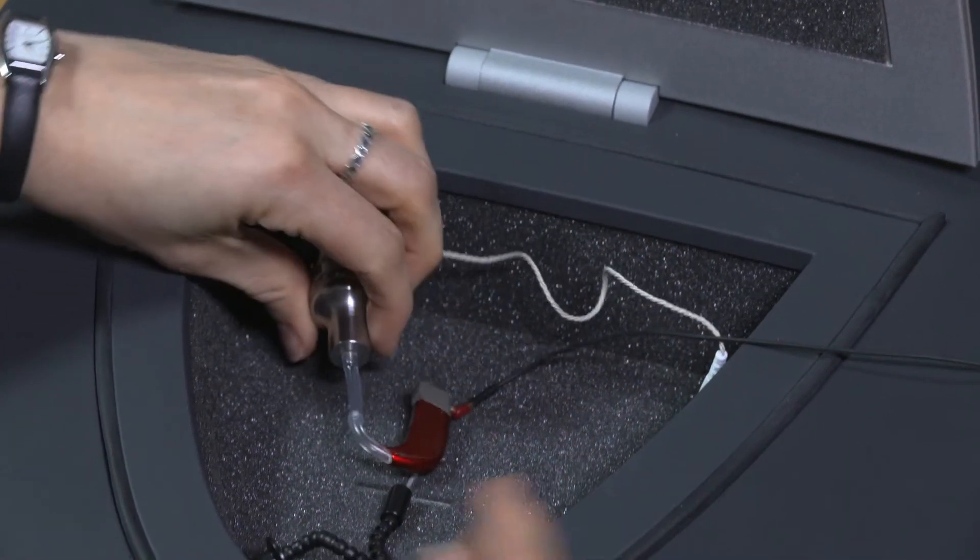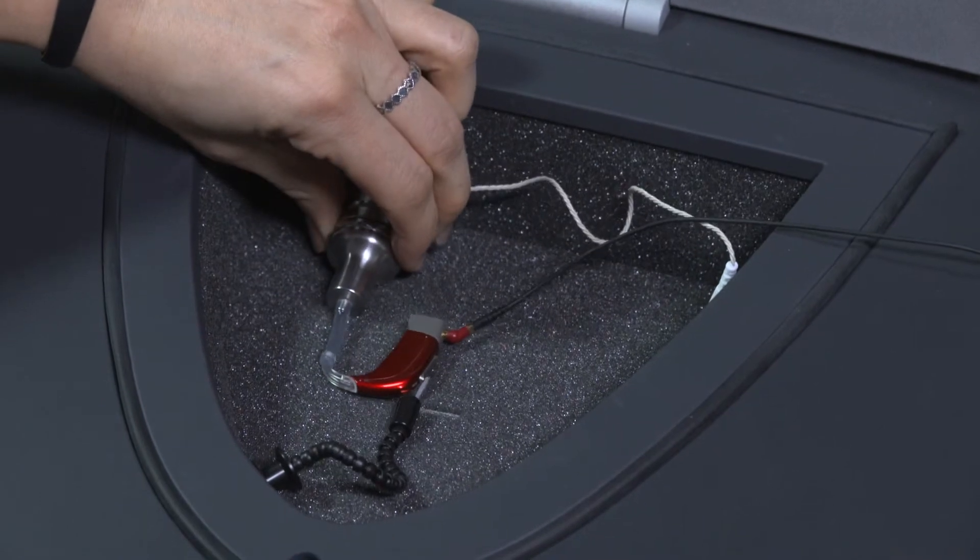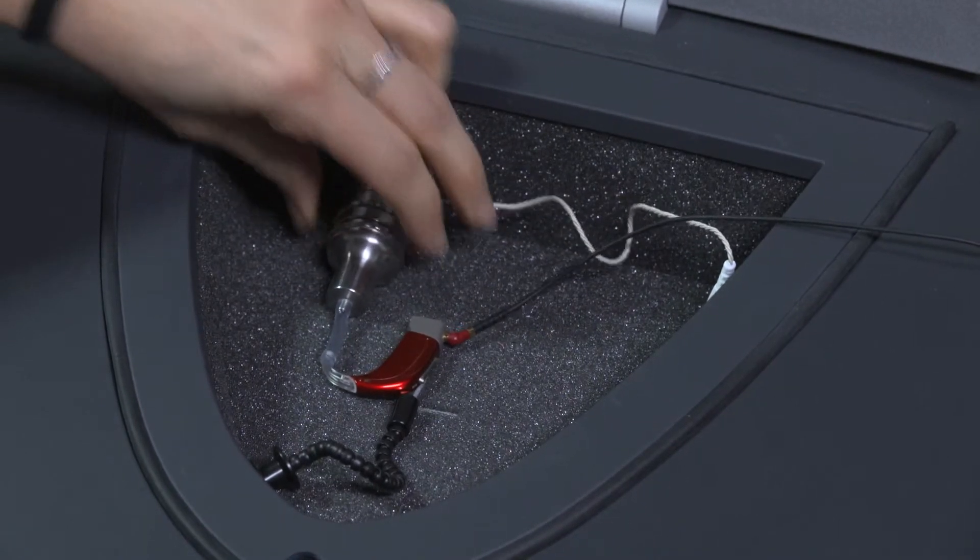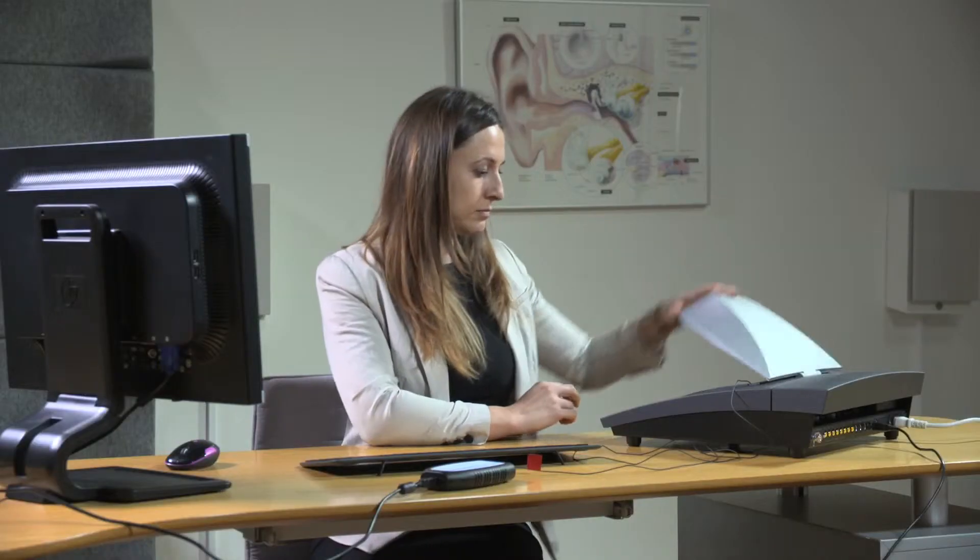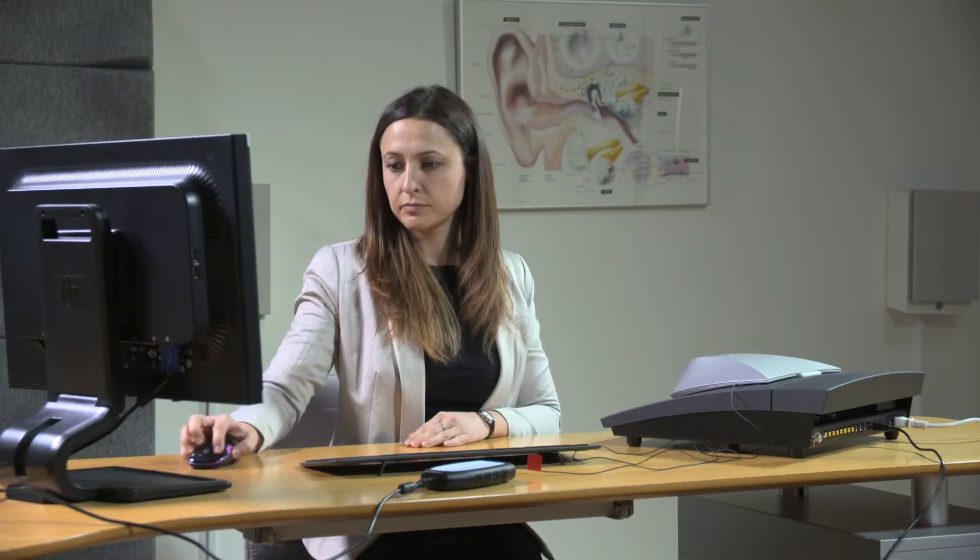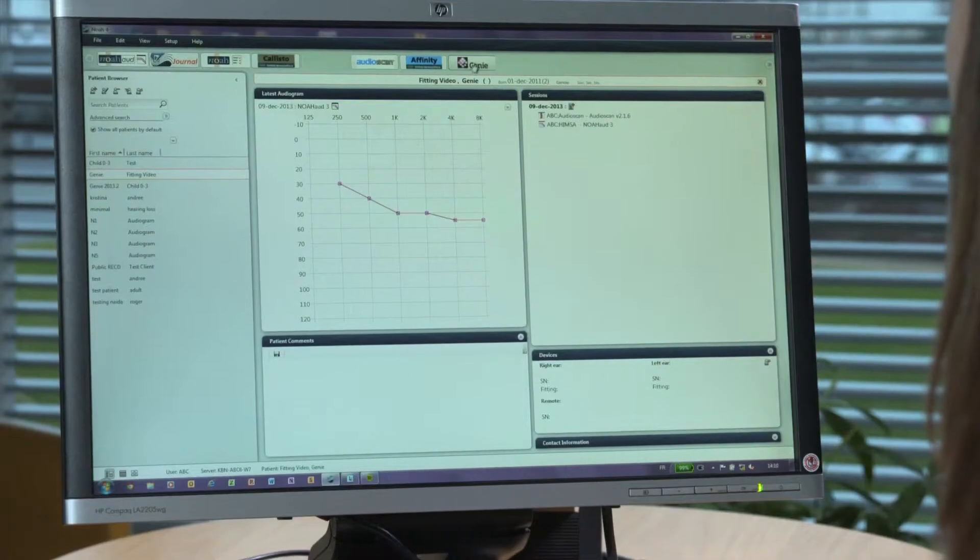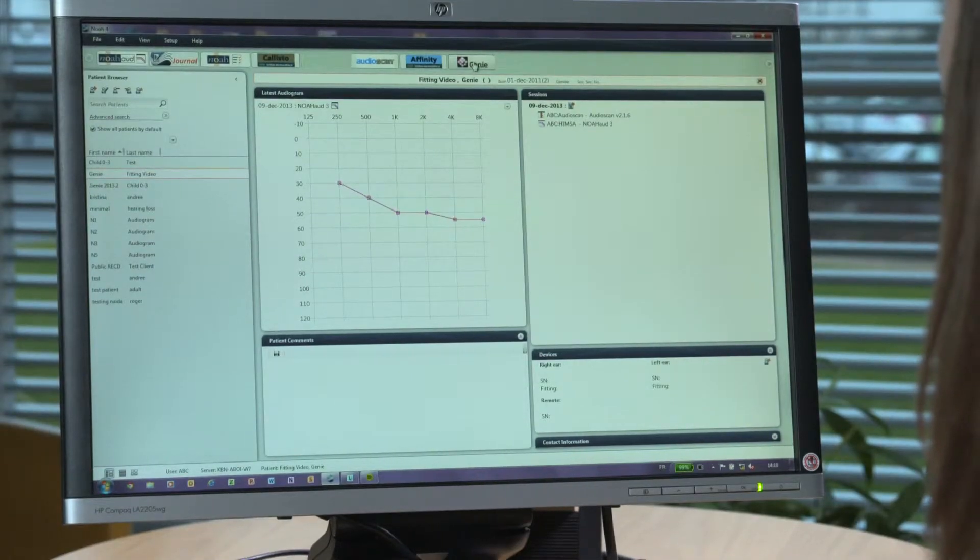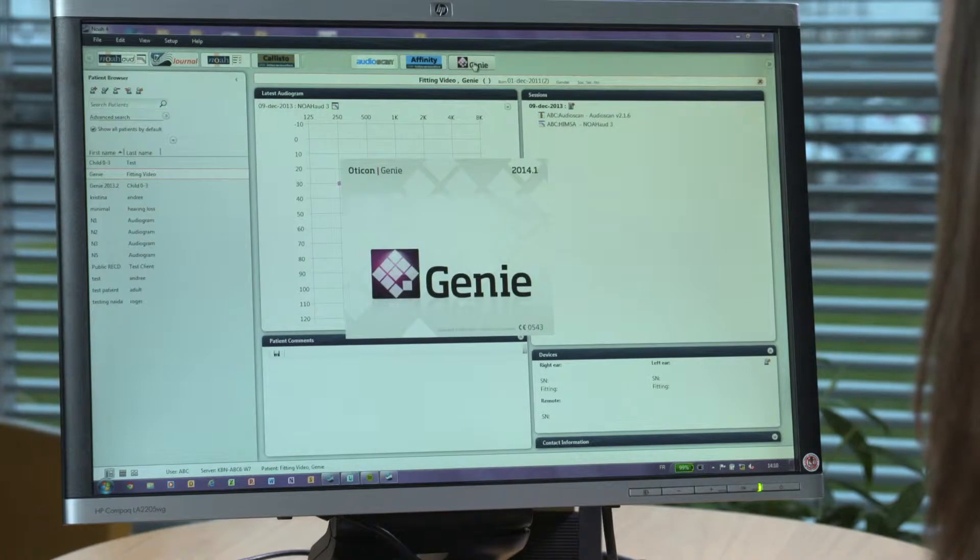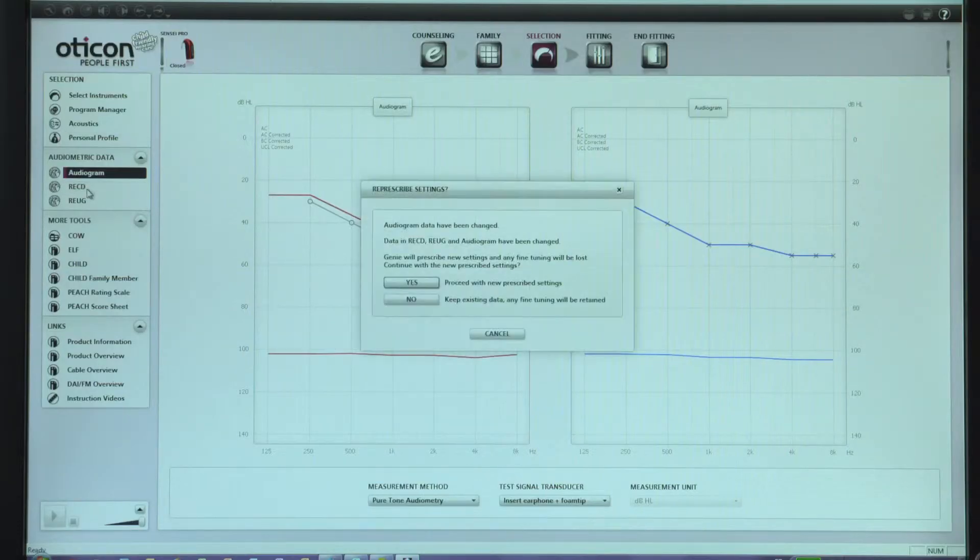We also need to take into account the child's individual ear acoustics by measuring the real ear to coupler difference. This short video will show you how to perform coupler-based verification using the Sensei Pro hearing instrument, the Gini software, and the Interacoustics Affinity System. We'll also show you how to incorporate the RECD measurement into the hearing aid fitting.